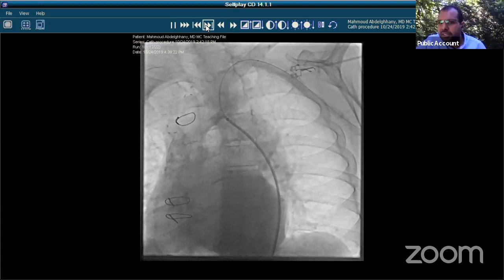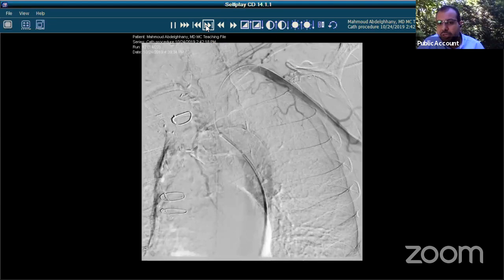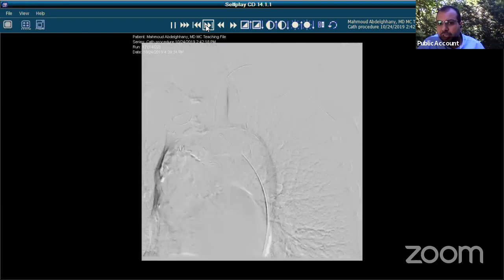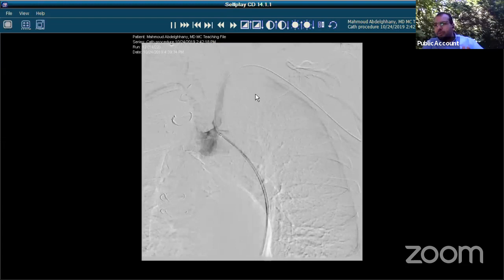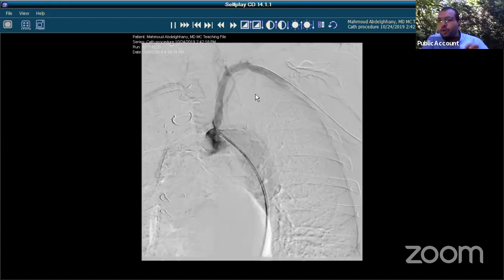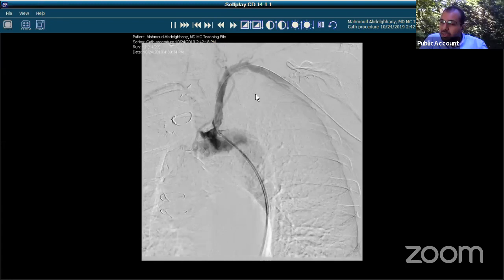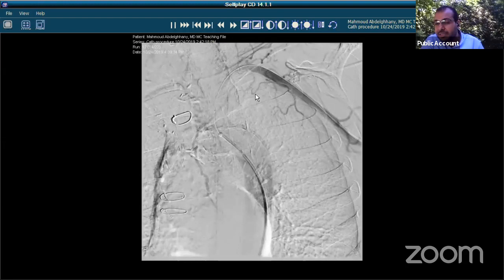I performed sequential balloon pre-dilations — first a 4 mm balloon, then a 5 mm balloon taken above nominal pressure. Post-dilation images showed improved lumen with the LIMA now filling, though the lumen remained inadequate. With a working lumen now established, the covered stent — a Viabahn — could be delivered through the 7 French destination sheath. The Viabahn has good trackability; the Lifestream is also an option. Most covered stents require at least a 7 French sheath, and at 9 mm diameter an 8 French may be needed — precluding transradial delivery in most cases. With the pre-dilated lumen, stent delivery was now feasible.